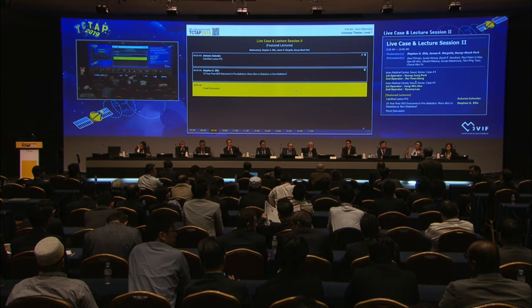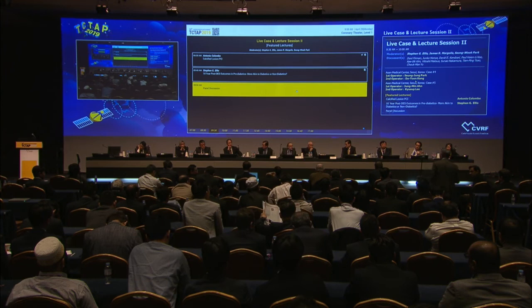But even with the new one, if you do it on the way back, I think in an angulated segment, you get a real interesting advantage. I want to make a comment on rotablator, which is that the way we use rotablator now is much different than the way we used it in 1990. In 1990, we tried to get as big an opening as we could with the largest burr, but now there's really no reason to go beyond a 1.5 burr, because if you do a good job of debulking with the 1.5 burr, you change the compliance of the vessel, and now it should be pretty easy to stent. And you could prove that by using the balloon, as we discussed a few minutes ago.